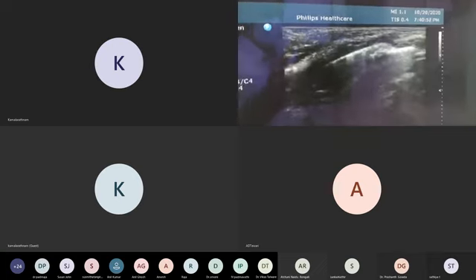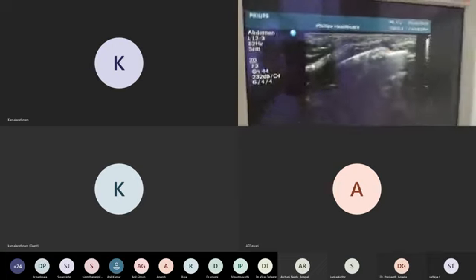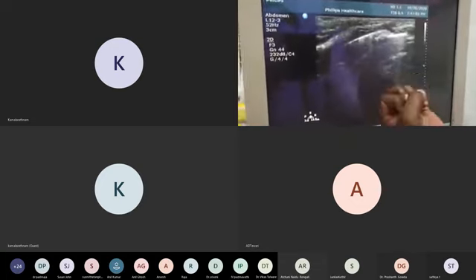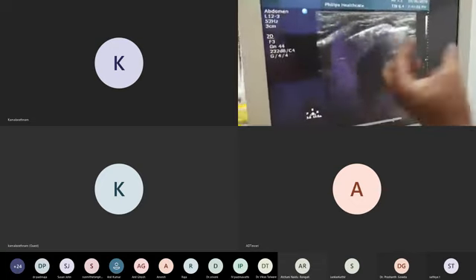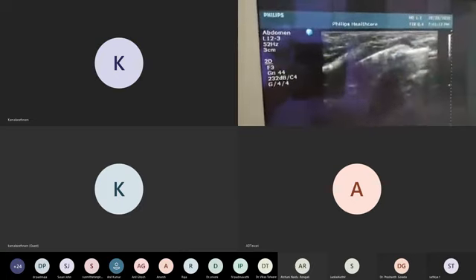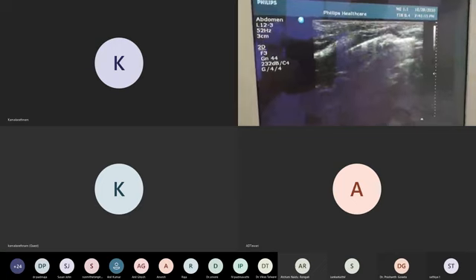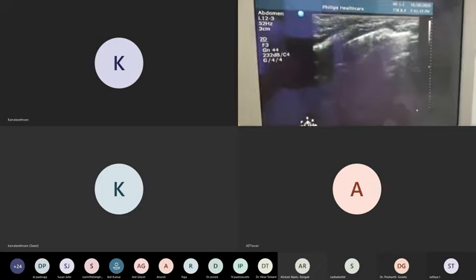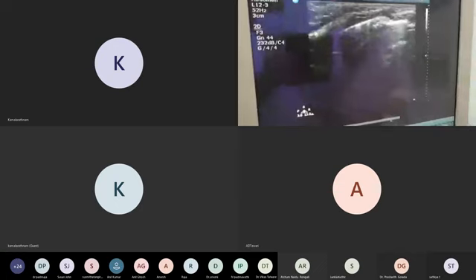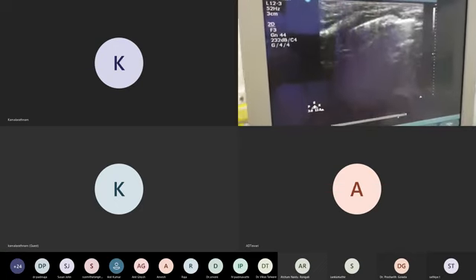So remember always, then don't think, oh, here is some problem. No, don't think. Just see the lung pulsation. That means with each heartbeat, the lung is also pulsating. Then that one is the shimmering line sign. What do you mean by shimmering line? Suppose you are going in a car in a summer place, I don't know what English word you will use. We feel like the road very far away has water.